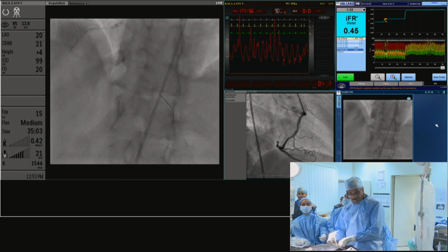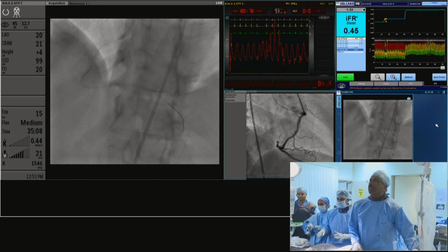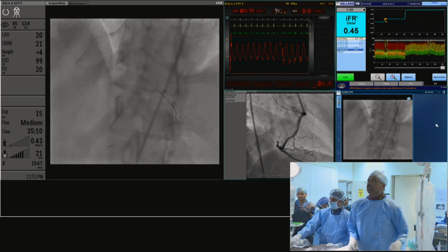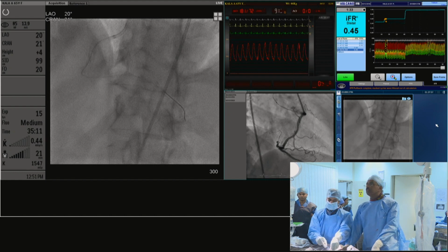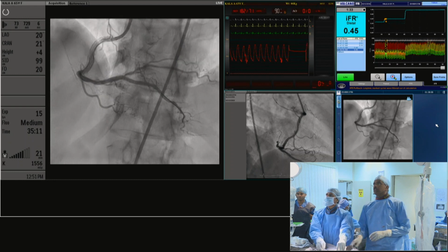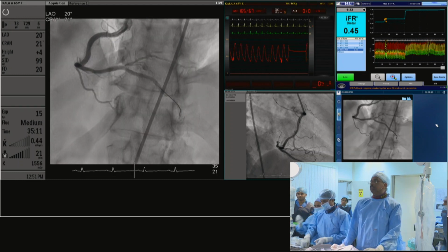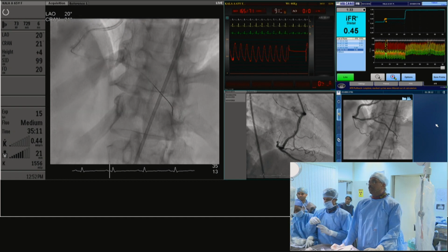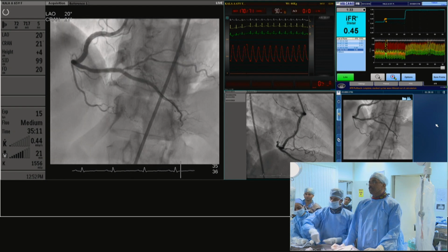There are numerous methodologies, and I would have followed all those methodologies to get the stent downstream. The first question that comes to my mind is, is there no way one can get a stent downstream to that discrete distal lesion? I know a long stent has been put, but in practical terms, even a short stent could have been put, because there was only a focal area of stenosis which was clearly significant on IFR, not a whole length of a lesion. And to treat that, one could get stents which track better.